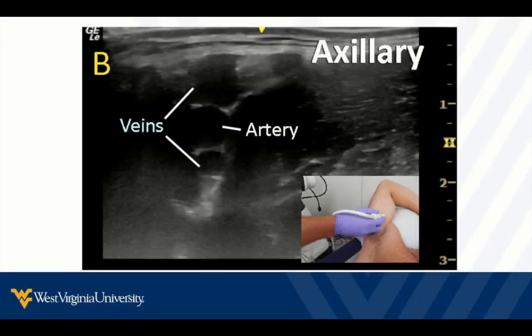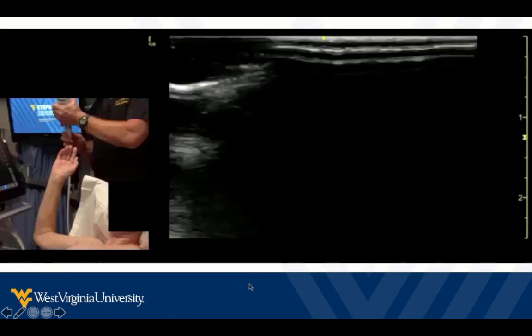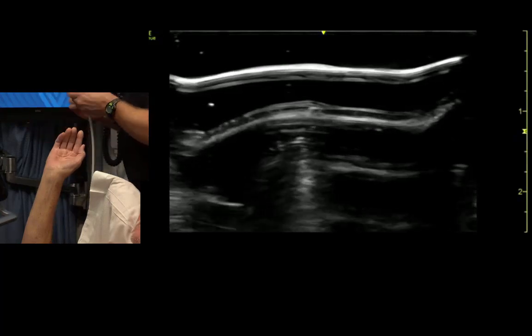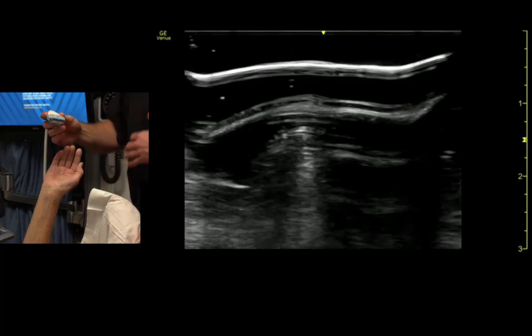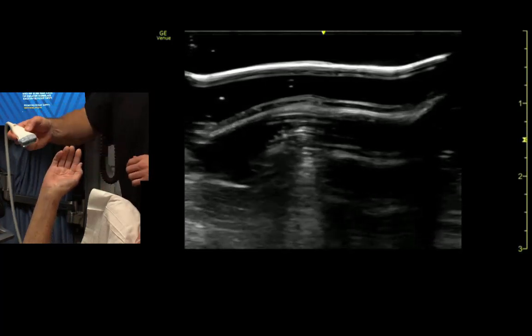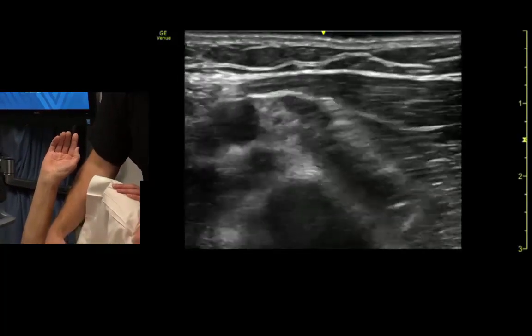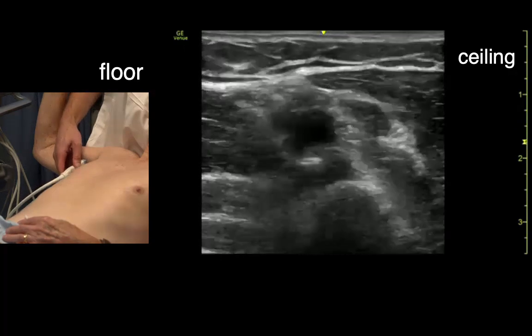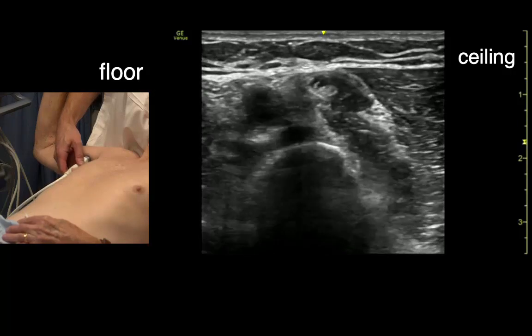After following the brachial artery and brachial veins all the way up the arm, we basically get into the axilla. Sometimes there are a pair of veins here, sometimes you only see one — it starts to get pretty big here, so it's easy to find, and again it's in contact with the artery. In this video, the operator is standing behind the patient — that's not necessary, we can do all this from the front. We identify the axillary artery and vein; the vein is compressible, the artery is not.